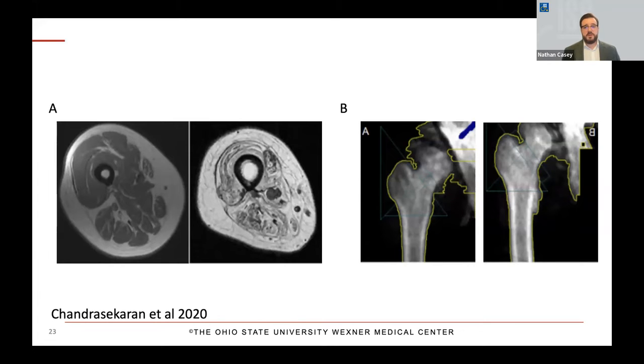The image in B, the one on the right, we see increased areas of white, brighter whites. And what that indicates is increased bone density as opposed to the individual here on the left. And so what we know is that bone density obviously has implications with seating as well, and increased risk of fracture. So again, if we can utilize electrical stimulation to help improve these things, I think it's certainly worthwhile.